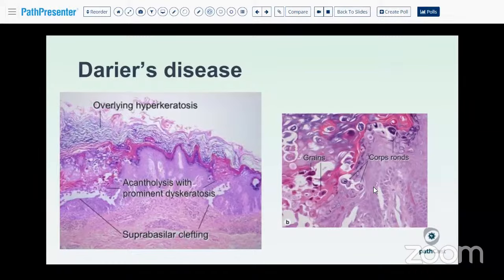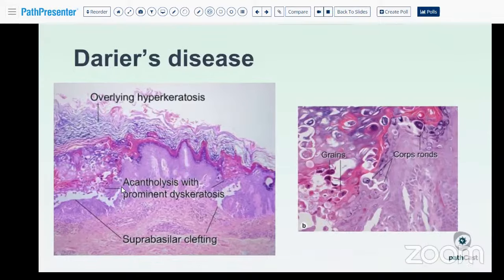Incorrect answer choices for this case were Darier's disease. So I'll go over distractor choices and also compare them side by side with the correct answer choice. Darier's disease is a condition that statistically presents with histopathology of hyperkeratosis, and the prominent reaction pattern that we see is called acantholytic dyskeratosis. So acantholytic dyskeratosis is an important pattern to recognize.